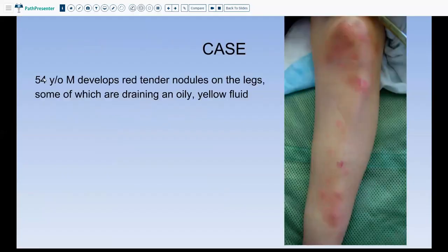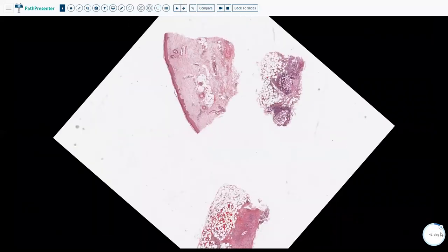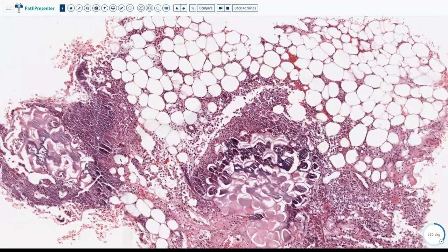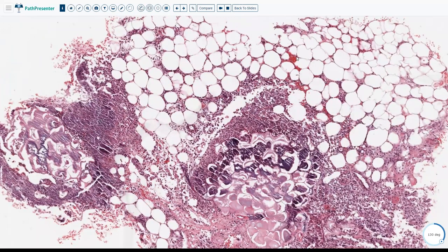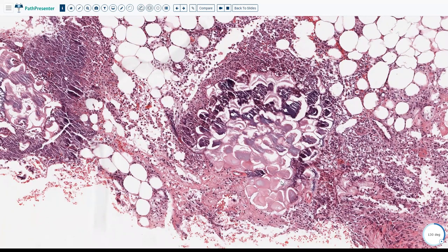Here is a 54-year-old male who developed red tender nodules on the leg, some of which were draining an oily yellow fluid. When we look at the biopsy, the main action is in the subcutis — the epidermis and dermis look pretty uninvolved. Going into the subcutis, we see that the lobules and the septa have a lot of neutrophilic infiltrate and hemorrhage. The very striking feature is this purple color — fat that has gone necrotic — known as saponification of fat, caused by enzymes being released into the fat, leading to digestion and necrosis.